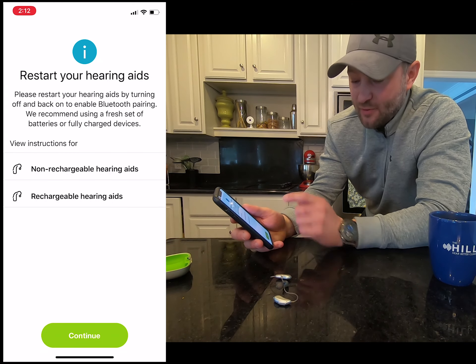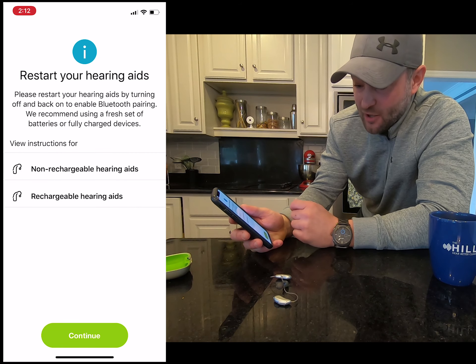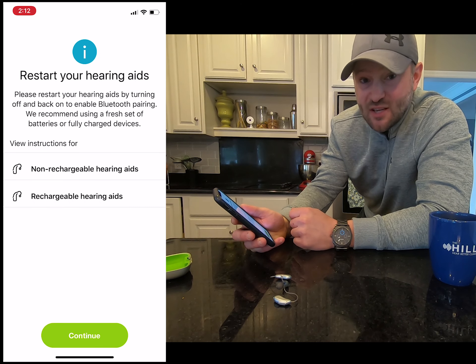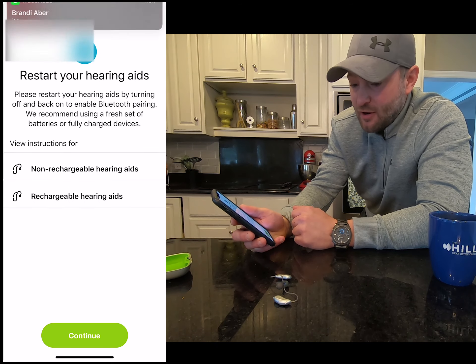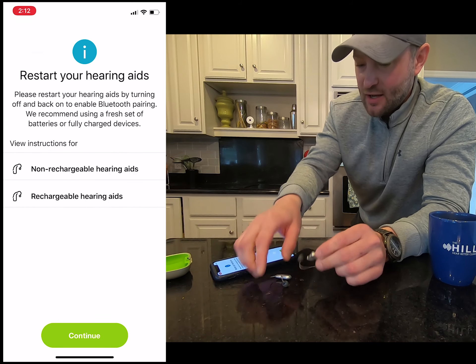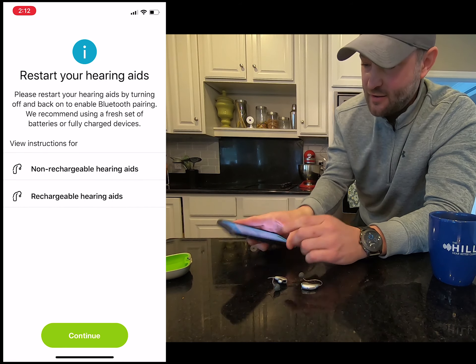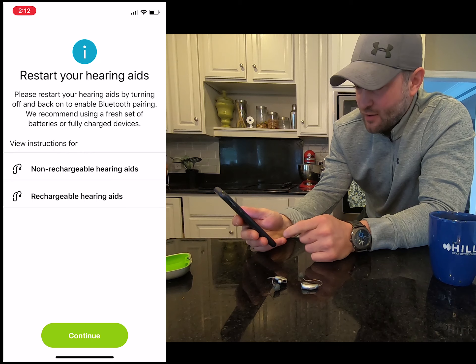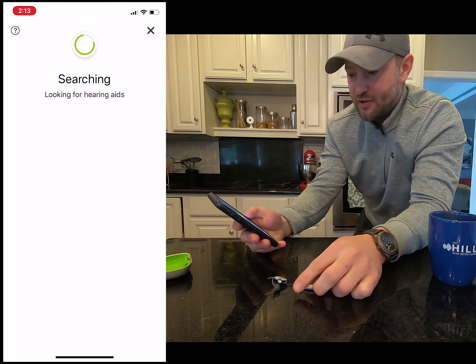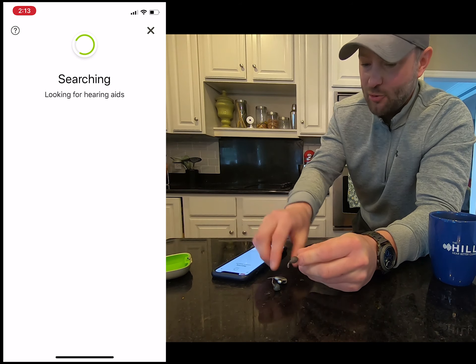The next thing we want to do so we can have remote control to change programs, volumes, and things of that nature is find the app. You'll want to download the My Phonak app — this is what it looks like. I'm going to click on it and it'll walk us through it. Right now I'm using a non-rechargeable hearing aid; if you have a rechargeable hearing aid you can turn them off by holding the bottom button until you see the red light, or just place it in the charger. I'm going to open the batteries.